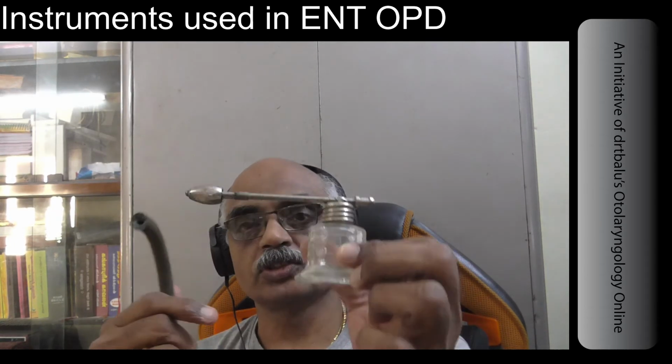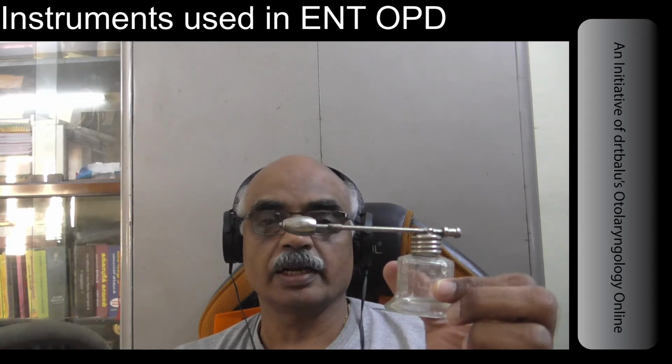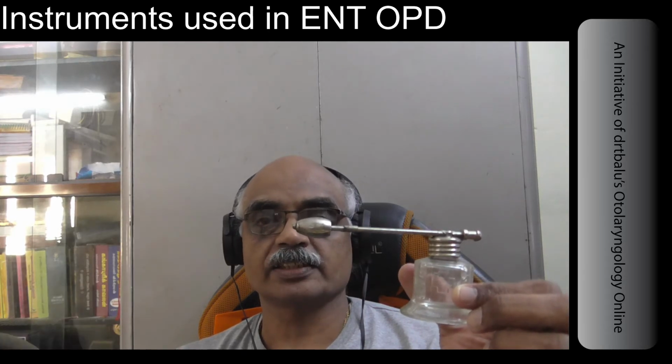The spray was used to spray 4% xylocaine into the throat to anesthetize the throat. You can use the same spray to anesthetize the nose by spraying the nasal cavity.